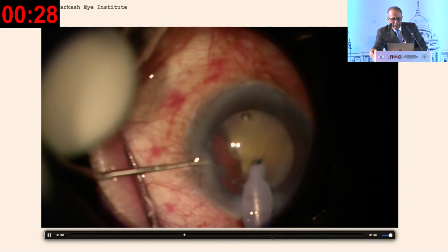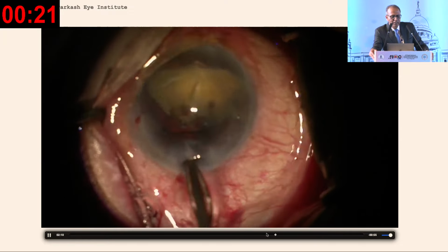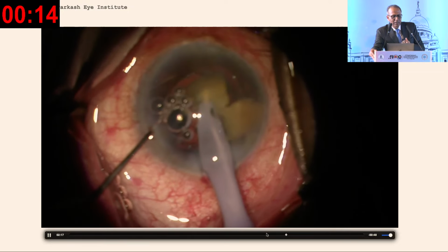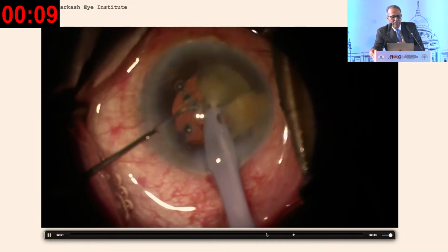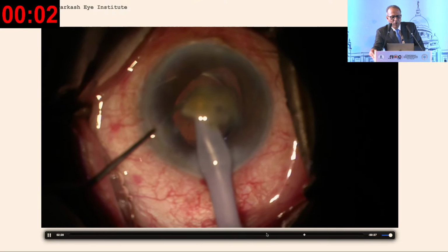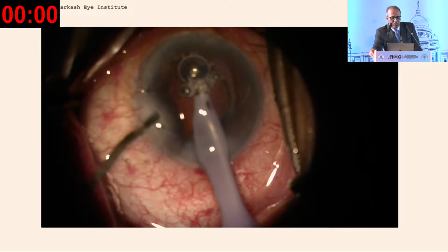And then the next step would be, once I do it, I'll use IOL scaffold, which would be aptly shown as and how we go ahead in the course by Dr. Priya and Dr. Amar. And you will see now what is the advantage. It acts as a PC, the IOL. You can work at a deeper level. You can take care of the endothelium and the posterior capsule and the nucleus from going behind. And I'm doing it in a slow way. When I'm doing it in a slow way, it's just sticking to it with less fluttering, stable chamber settings, and the case was easily completed.